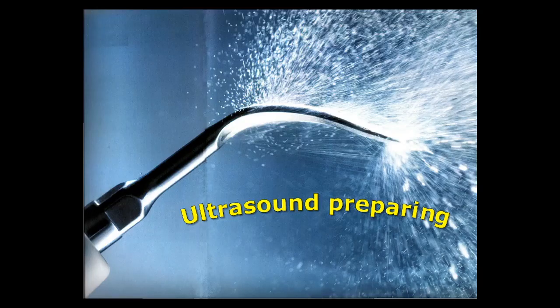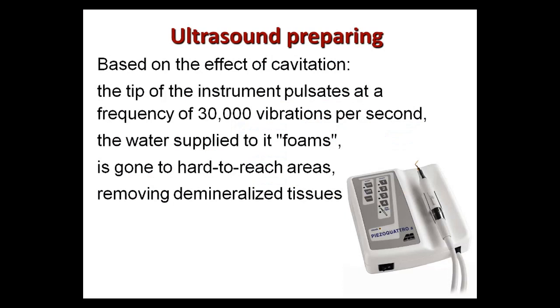Next way of alternative preparation is called ultrasound. It is based on the effect of cavitation. The tip of the instrument pulsates at a frequency of 30,000 vibrations per second. The water supplied to it goes to hard to reach areas, removing demineralized tissue.